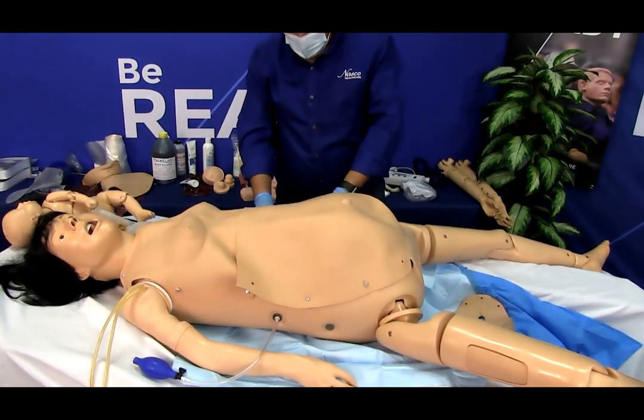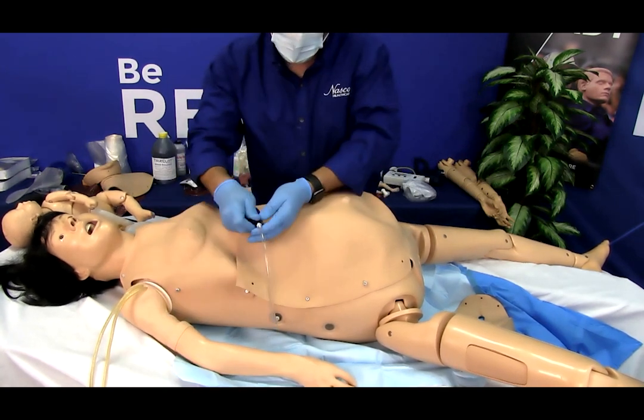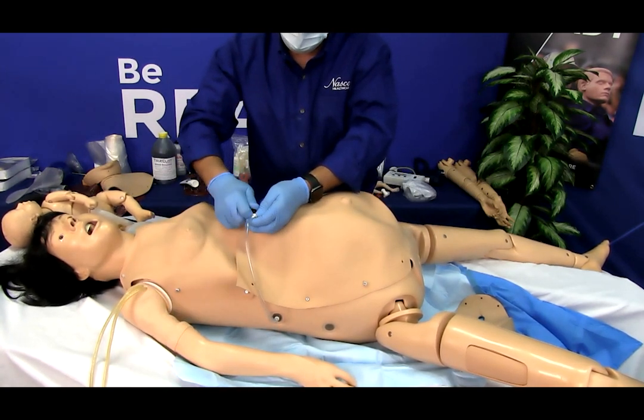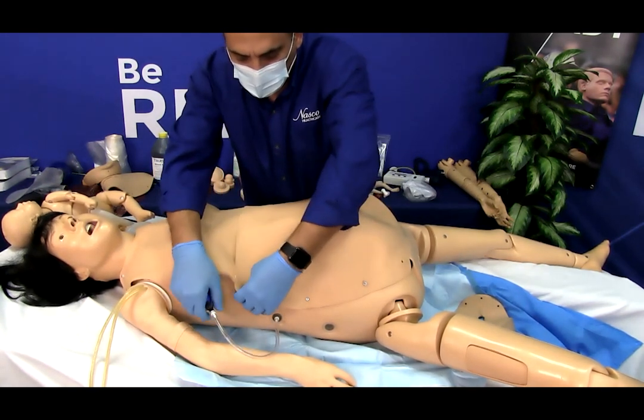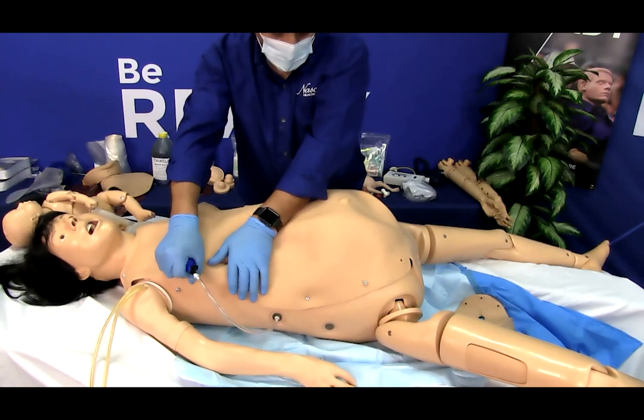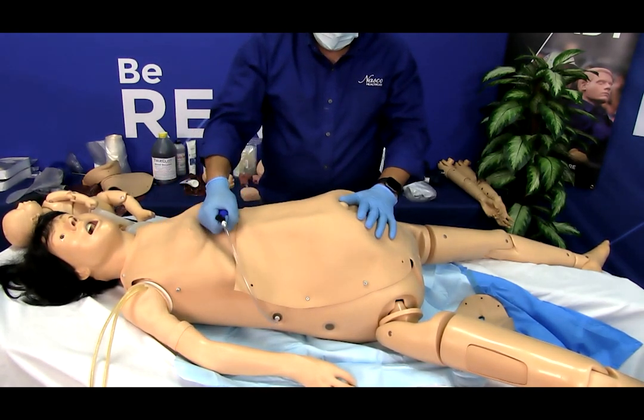Adding 3 to 5 pumps of air will increase the firmness. Opening the air valve completely will give the fundus a soft or boggy feel. Closing the valve will result in a firmer uterus. Please avoid overinflating the fundus, as this will damage the simulator.